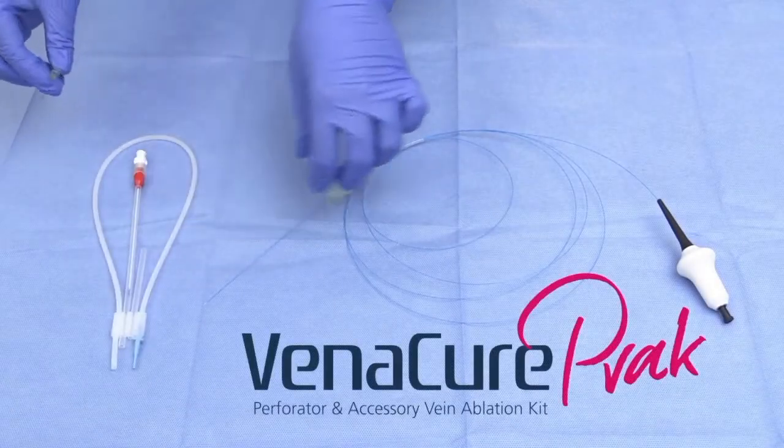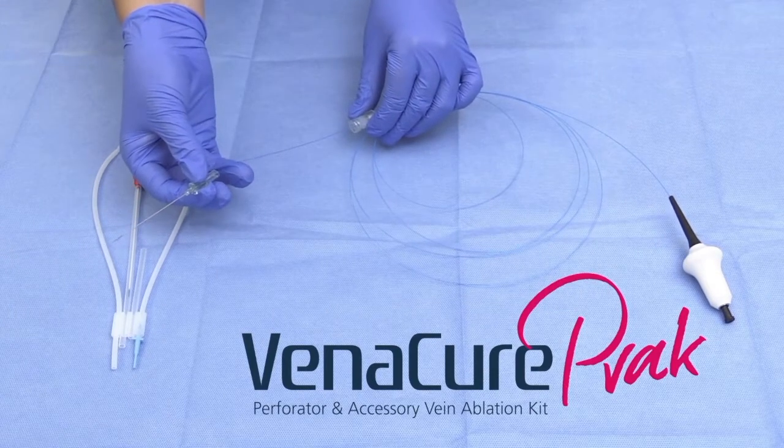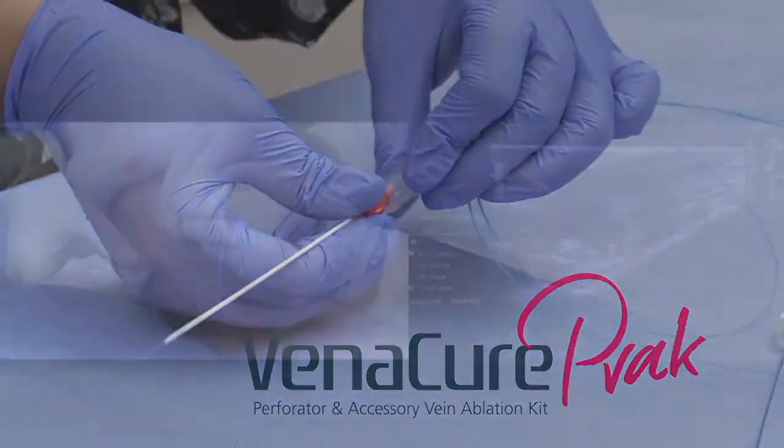Introducing the Venocure 400 Micron Perforator and Accessory Vein Ablation Kit, which lets providers treat refluxing perforator veins with the precision of the Venocure EVLT system.